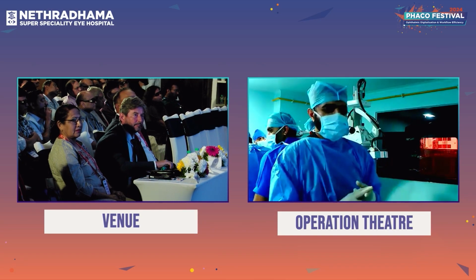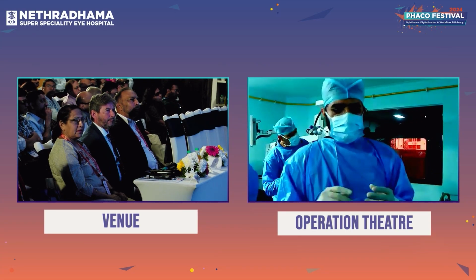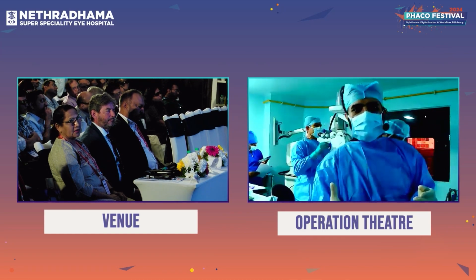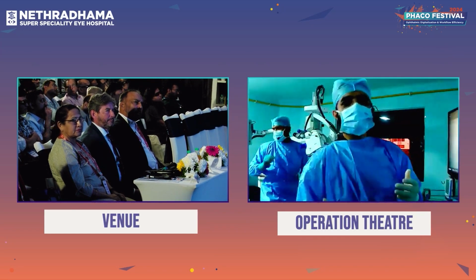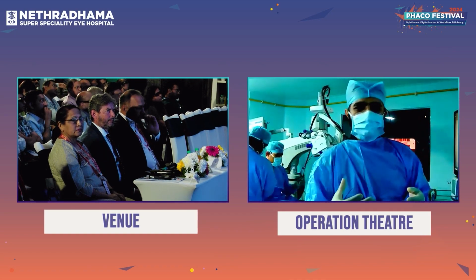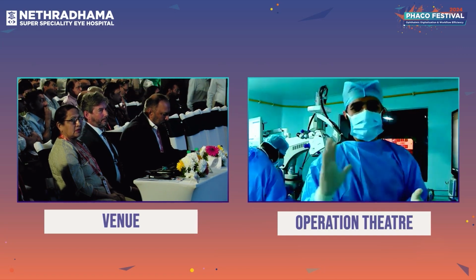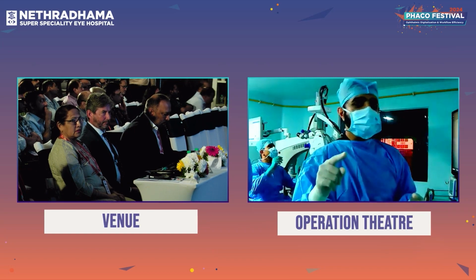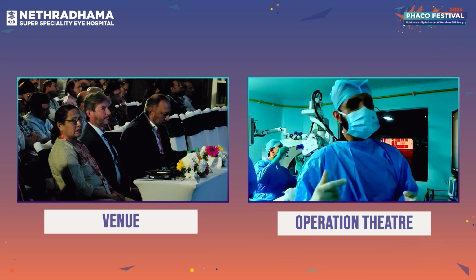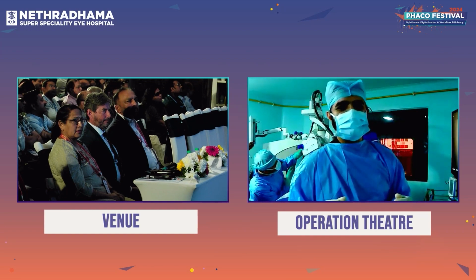Yes, sir. The important thing is, if the grade is on the higher side, after you finish your chopping, just before you start your phaco emulsification, fill the chamber once again. When you're actually doing the chopping, whatever phaco energy you're delivering is all going into the lens, so that won't damage the endothelium. It is the energy you use for your quadrant removal where the damage happens. So it's important to fill up and then do your quadrant removal, and automatically your corneas are nice and clear the next day.